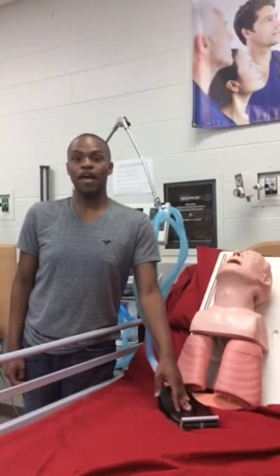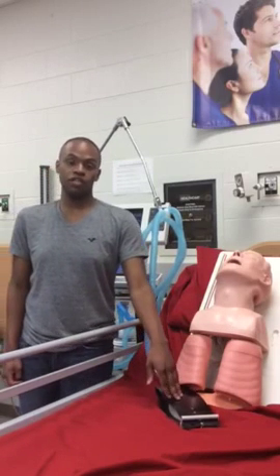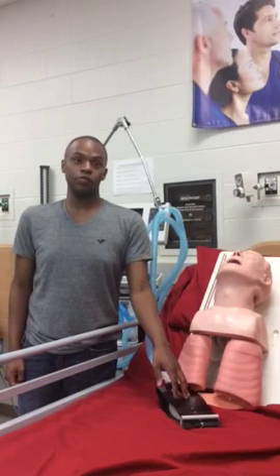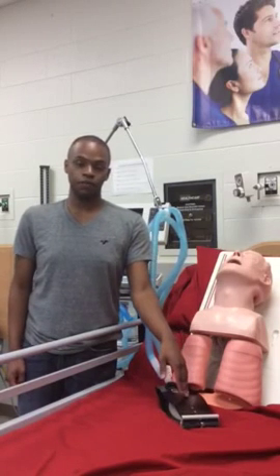Next, I look at her vital capacity. Normally, we would want the vital capacity to be 4.8 liters. Hers happens to be 3.6 liters. But what we have to keep in mind is that she has COPD. So we know she has a problem getting air out. So the 3.6 liters is good for her.